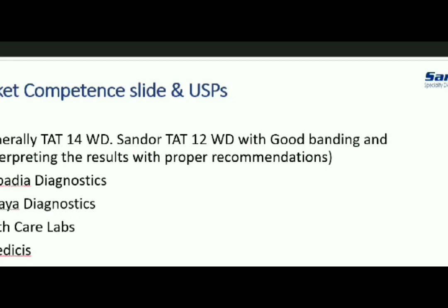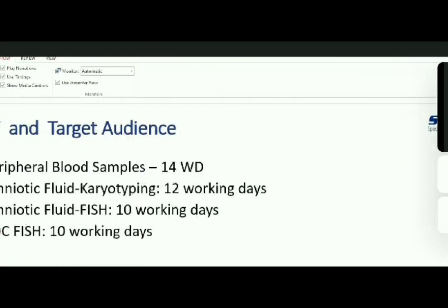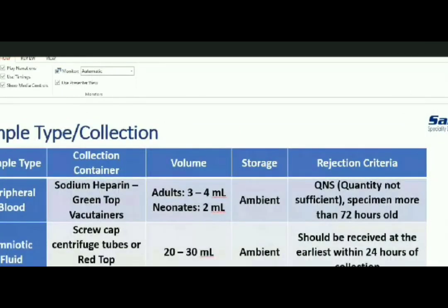Okay, and sir, can I see the previous slide, sir? Yeah, this one. Sir, apart from heparin tube, we can use the red cap also, like plain tube. No, you are talking about peripheral blood or amniotic fluid or POC? Peripheral blood, ma'am. Okay, in peripheral blood, only sodium heparin is required. Okay, no other vacutainers.